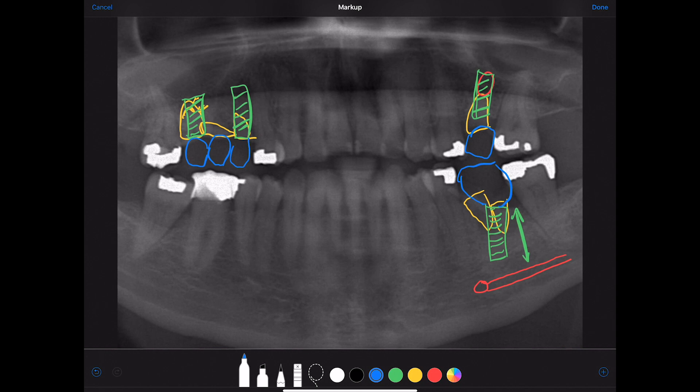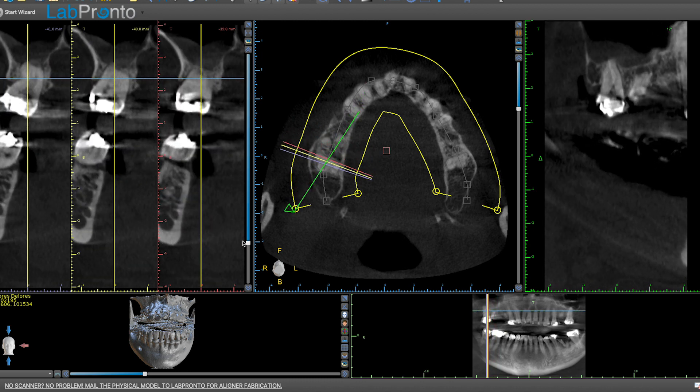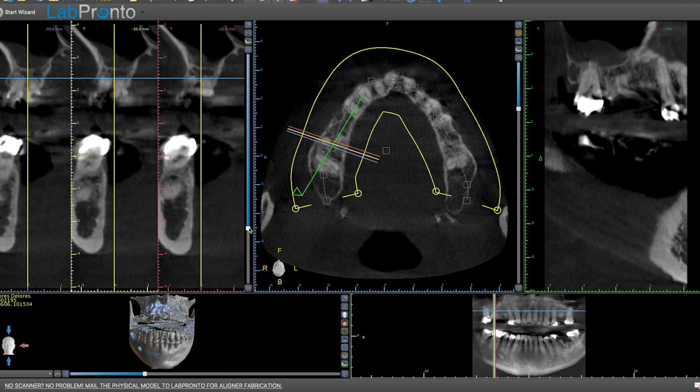That's a great overall perspective from the panoramic, but now let's look at the cone beam to see more clearly what's going on, especially in this area. Looking at the upper right molar retained root tip, you can see that root tip goes pretty far — measuring it, you only have about two millimeters of bone, and that's really soft bone. Not good for immediate placement in my book, so I would extract that, graft it, and wait.